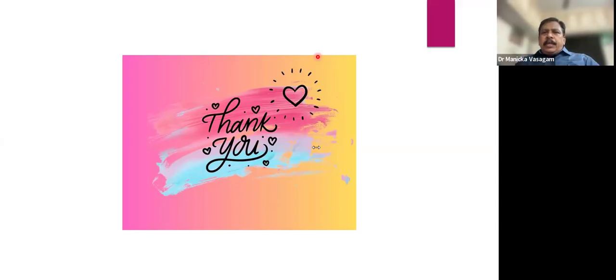Okay. Any easy method to bypass ledge? Ledge bypass definitely வந்து specialty ஓட portion sir. அது வந்து clinicல வந்து ledge பண்றது நீங்க address பண்ண வேண்டிய விஷயம் வந்து what size நீங்க வந்து initial-ஆ உள்ள insert பண்ணீங்களோ, you have to approach with the smallest size.